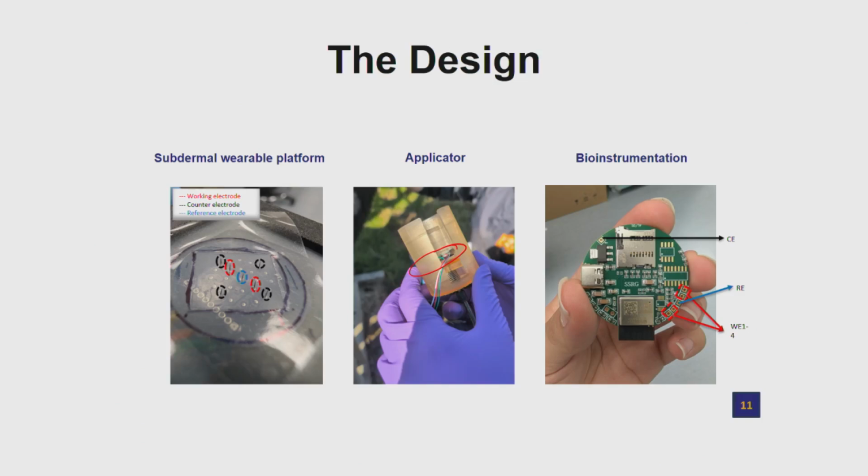There is an applicator to insert the device or implant it. Do we need something to remove it? This has to be in there for 14 days. Otherwise, I would have peeled it off and shown it to you. No, it's not for removing. Your question is whether you need another device to remove it? No. Even my mom could take it off when I implanted one in her. This is the applicator, and this is how it comes inbuilt.